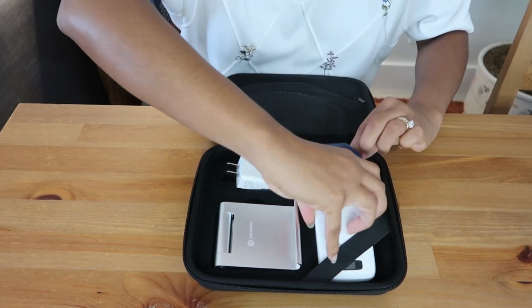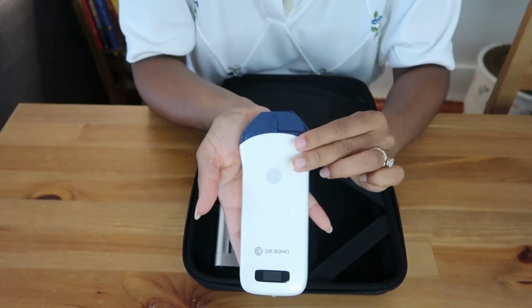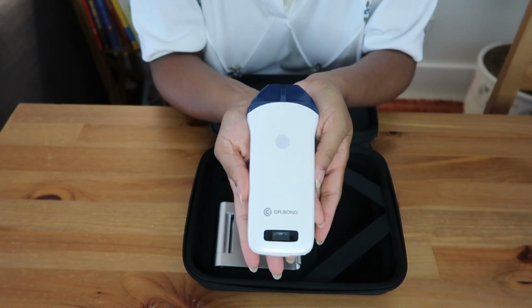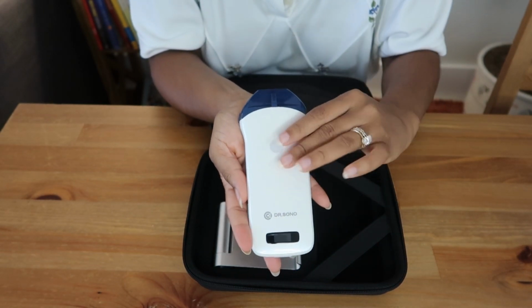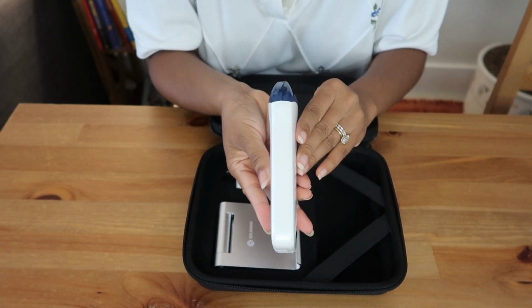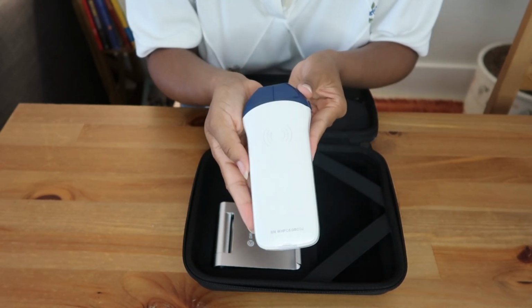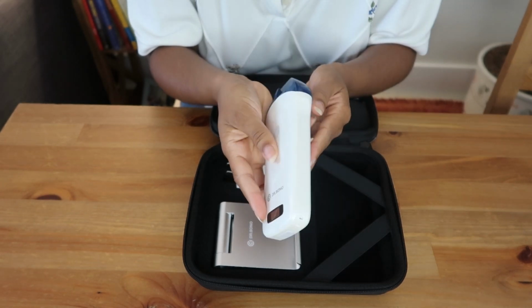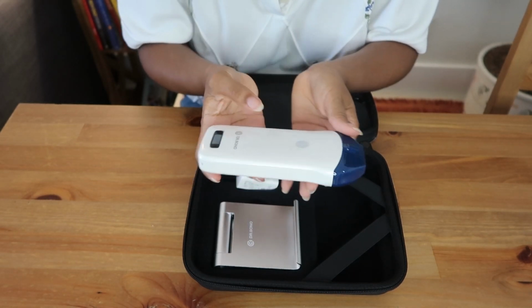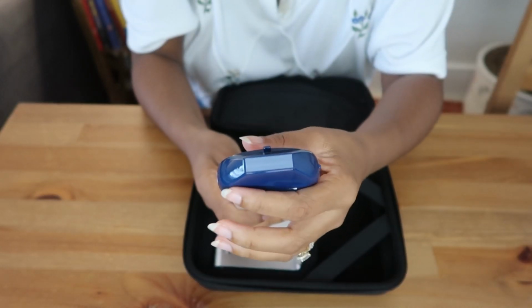So we have the linear probe today. This is going to be perfect for scanning small parts, vascular, MSK, of course, like thyroid, breast, and scrotum, which is a part of small parts. And I'm going to show you all that in a little demo later on. The little button that you see on top of the probe is what we're going to use to pause or freeze our images, as well as turn the probe on and off.